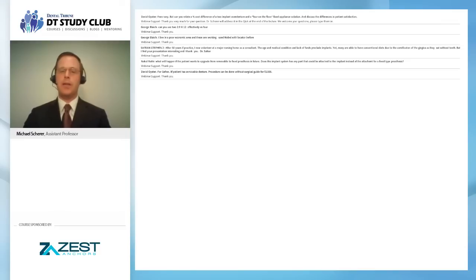I'm going to go ahead and jump back here with my slides so you can see. Go ahead and write down this information. That YouTube channel does have a great clinical case where the implant was too high initially. And in fact, it was a little bit off angle, just a hair, because as the implants sometimes go in, when you hit cortical bone that's dense and thick, they tend to migrate just a little bit. It goes through an example of when I encountered this surgically. I backed out the implant, retorqued it down, still achieved over 30 Newton centimeters of torque, and that allowed me to correct my angulation.